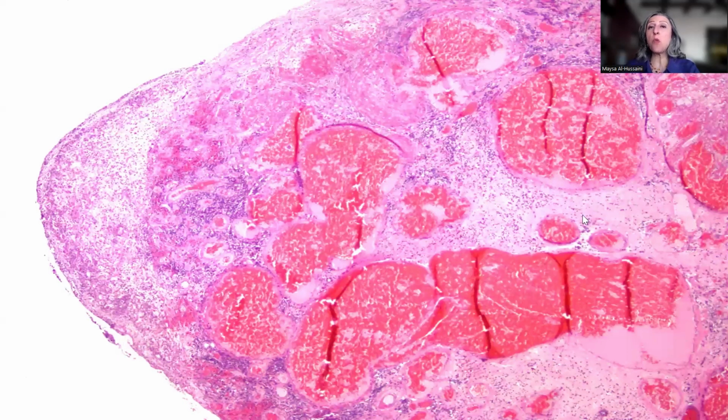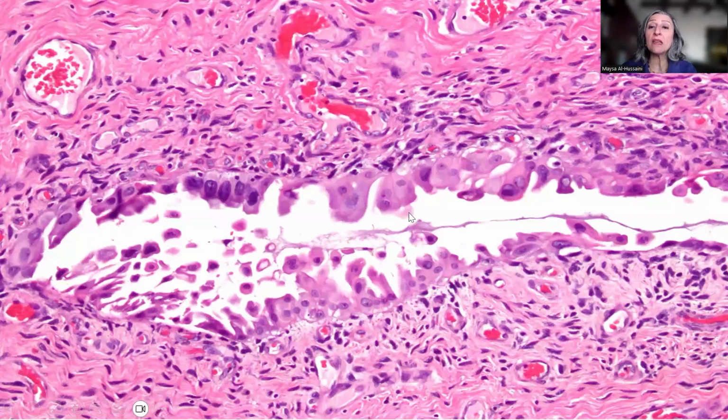Now, because the polypoidal mass was really big, protruding through the cervix, we expect that the tip of the polypoidal mass will show some necrotic changes with fibrin and congested blood vessels. But what was really worrying was that the glandular epithelium near this infarcted or necrotic tip was really very pleomorphic. And this is exactly what is called the hobnail type of metaplasia that we encounter, and this is a typical potential pitfall for calling this something higher grade, like serous carcinoma, for example, of the epithelium.